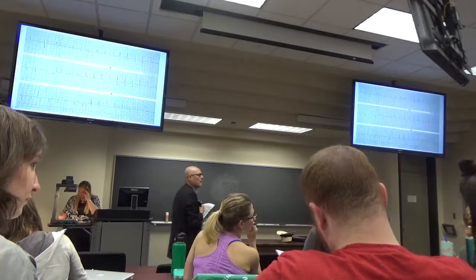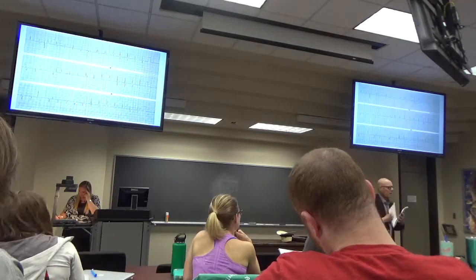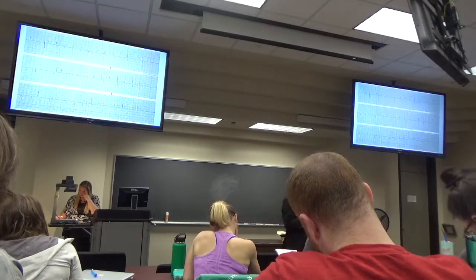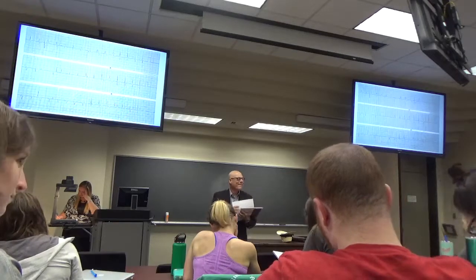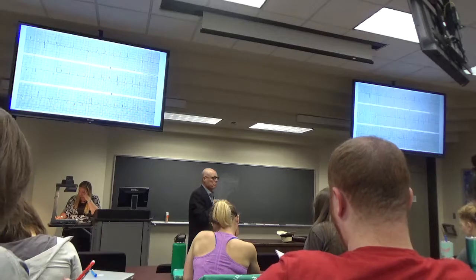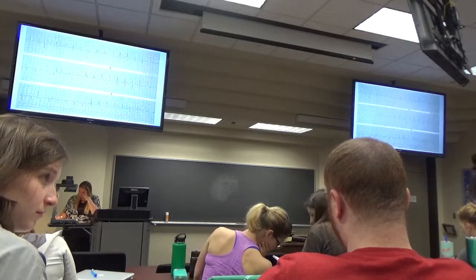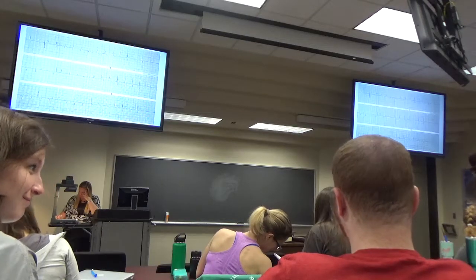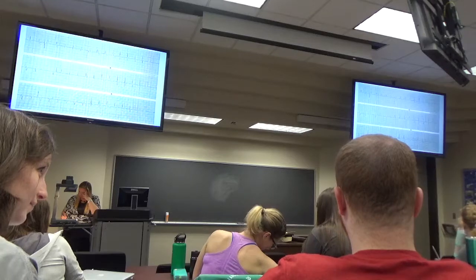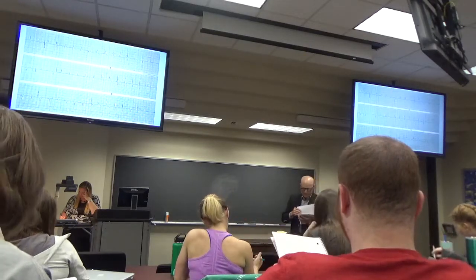Benign early repolarization is shown in V4. I'd leave that alone. Repolarization, by and large, is always benign. But it said if it's in V4, it's more benign? Well, what's the word I'm looking for? Trademark. I don't know about that.